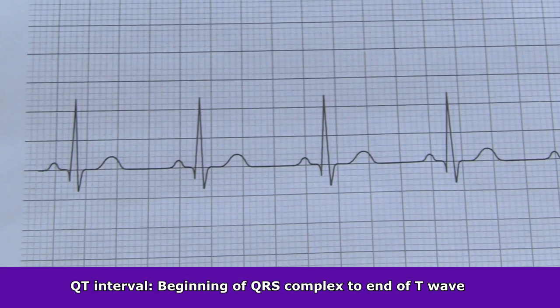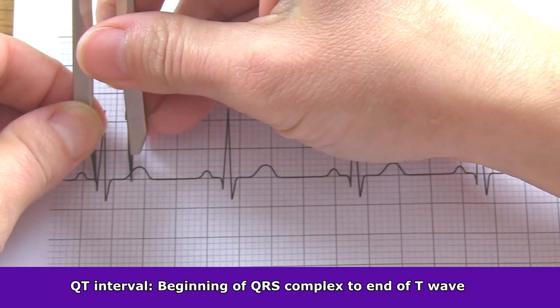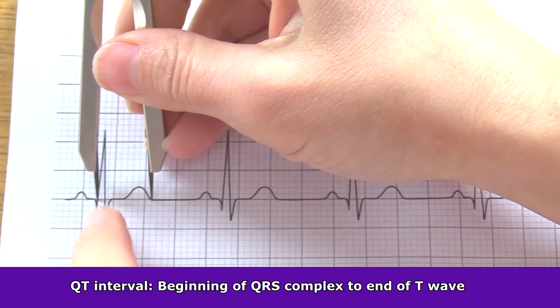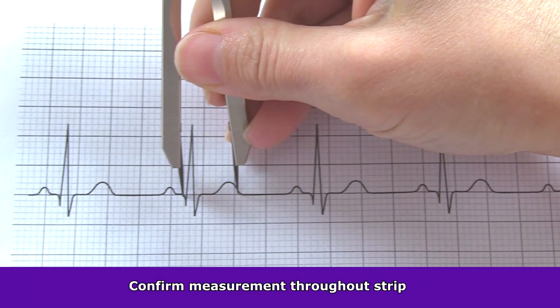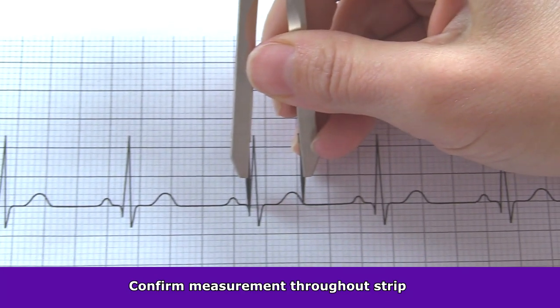Then you want to take a look at the QT interval, and again, that was found at the beginning of the QRS complex to the end of the T wave, and you just want to count the boxes from there to there. Here we have about 9 boxes, so that gives us 0.36 seconds, and just track that down all throughout the strip and just confirm you have that throughout.